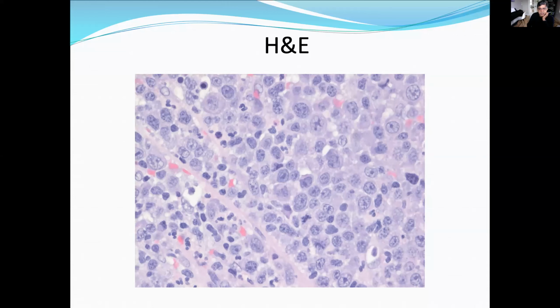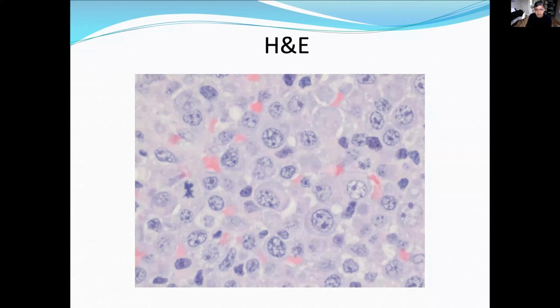And this is what it shows on higher power. They look bizarre and ugly looking. And then we look further, there's mitosis there. This is highly proliferating, so this is not good. And then we keep looking. There are cells like these.